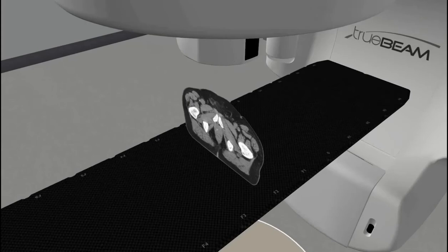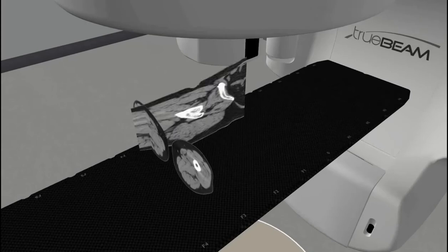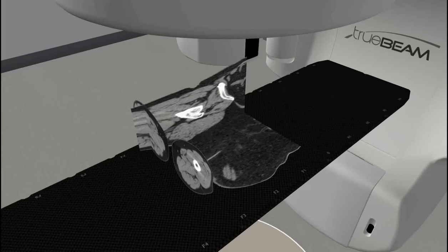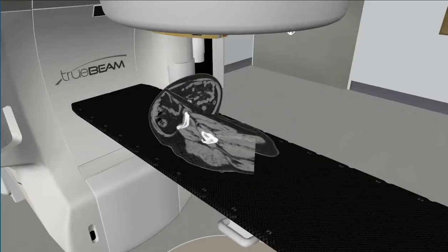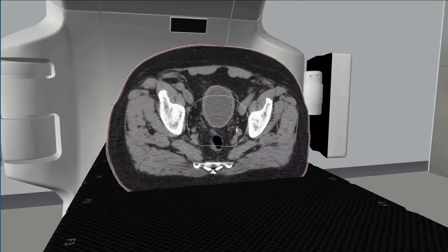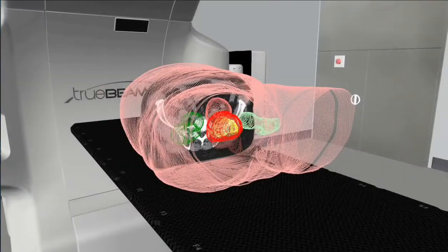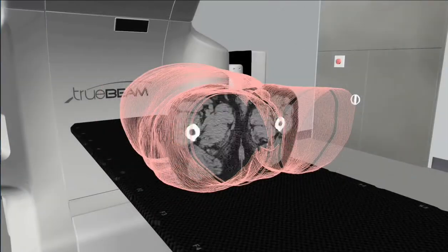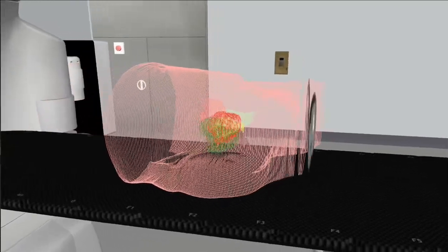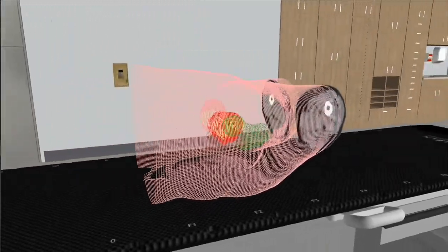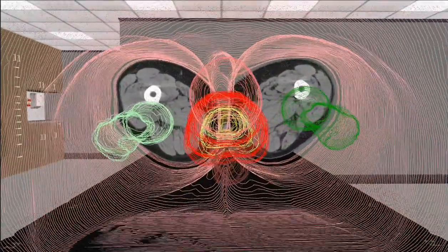VIRT accelerates the teaching of anatomy. With the ability to view axial, sagittal and coronal slices together, it helps learners read CT data and translate 2D image slices into 3D understanding. All the organs at risk and target volumes are transferred onto the axial slices to help students learn and understand contours and margins.